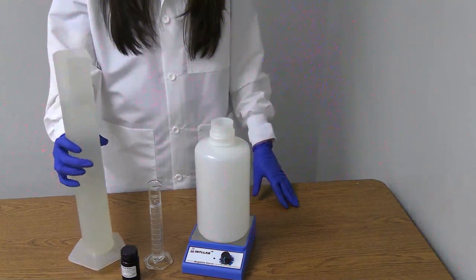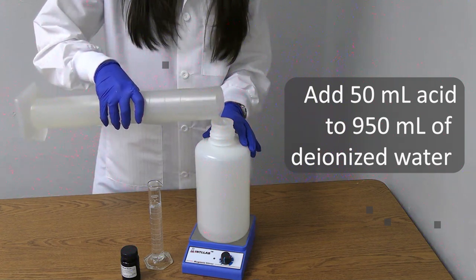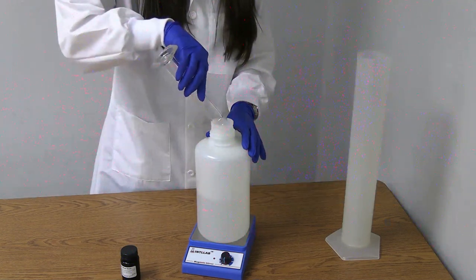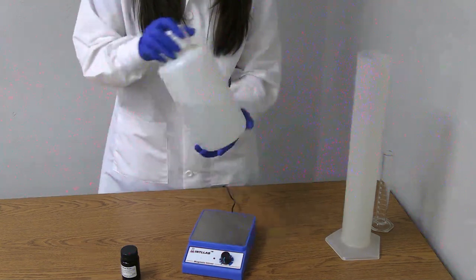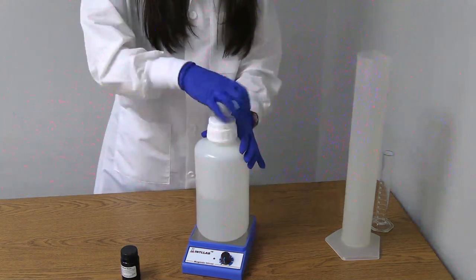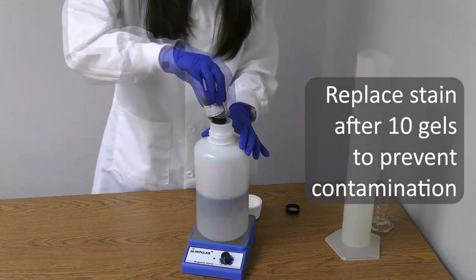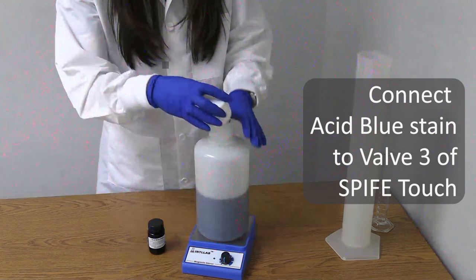For the acid blue stain, start by preparing 1 liter of 5% acetic acid. Combine 950 milliliters of deionized water with 50 milliliters of glacial acetic acid and mix. Next, gently dissolve the acid blue powder into the liter of 5% acetic acid, using a stir bar and stirring for 30 minutes or until completely dissolved. It's important to replace the acid blue stain after processing 10 gels to prevent contamination. Connect the acid blue stain bottle to valve 3 of the SPIFE Touch.